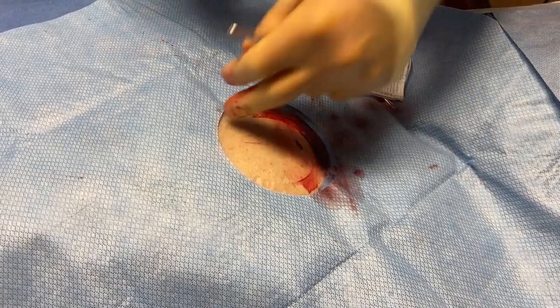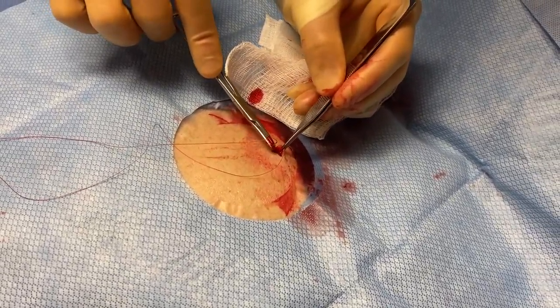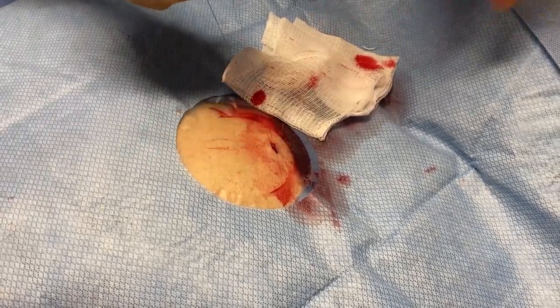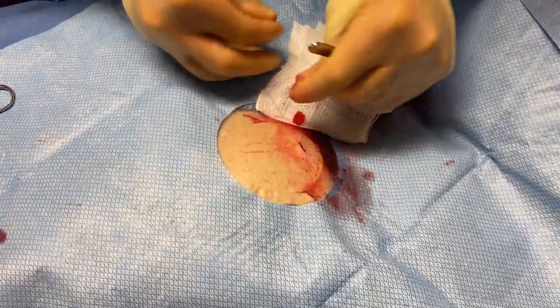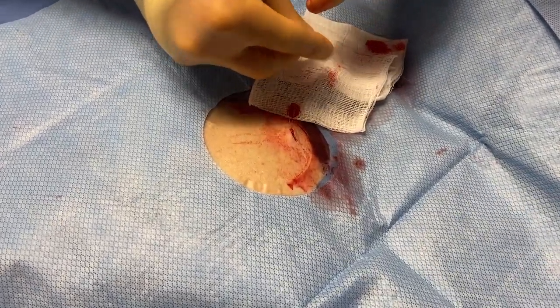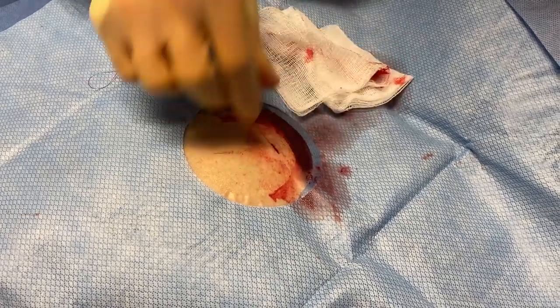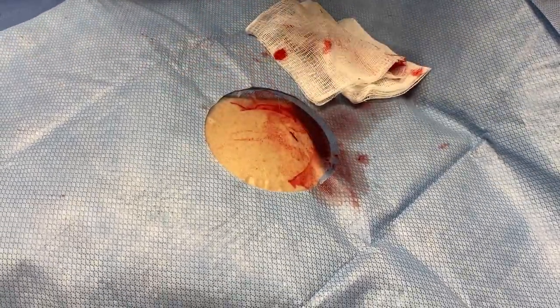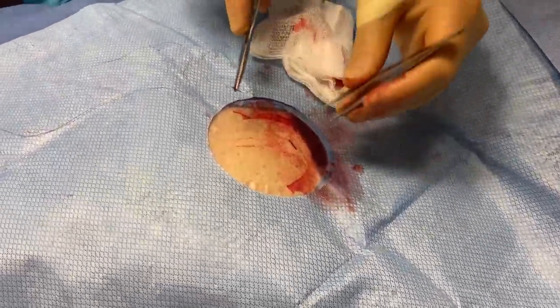Some people have argued that this is too much for a loop recorder, but I like it to be nice and tight. I feel like it controls hemostasis and I'm more guaranteed that we're not going to have an infection that we weren't planning for. Everyone's skin is a little bit different, and his still wants to have some separation, so I'll probably just do a few running subcuticulars as well to really hold this together.